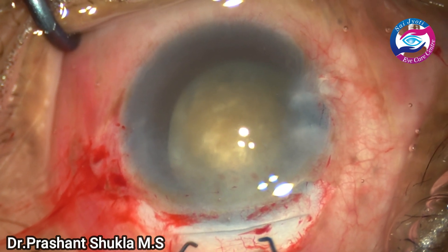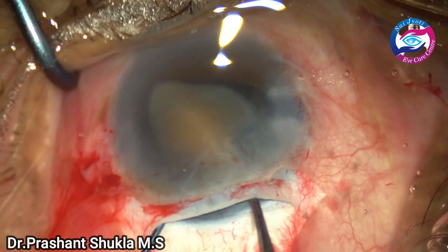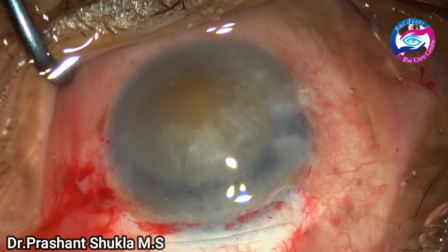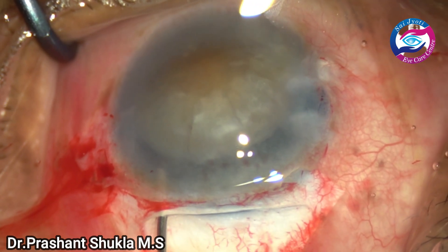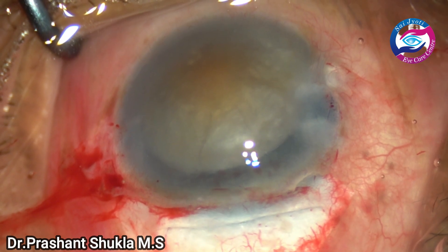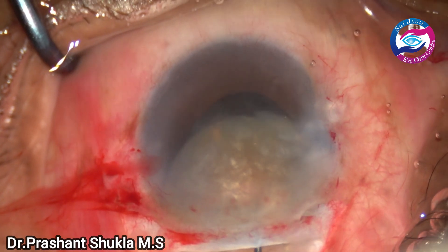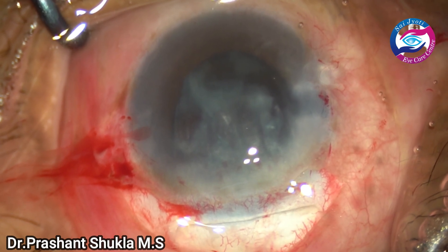Here I am taking two small Sinskey hooks — one Sinskey on the left side just pushes the nucleus towards the left, while the right one hooks the equator of the nucleus, and the whole nucleus is smoothly wheeled out of the capsular bag using the bimanual technique. Now is the time to deliver the nucleus out. Viscoelastic is still present both in front of the nucleus and behind to protect both the cornea and the posterior capsule. A phaco sandwich technique has been employed here — the nucleus has been sandwiched between the vectis and the Sinskey and gradually removed from the eye. We had a very smooth delivery — this is what we wanted.